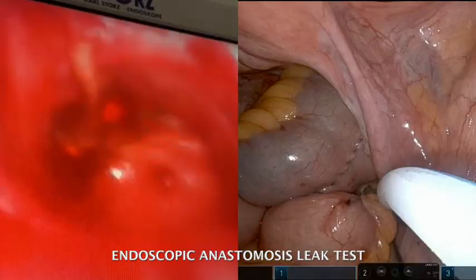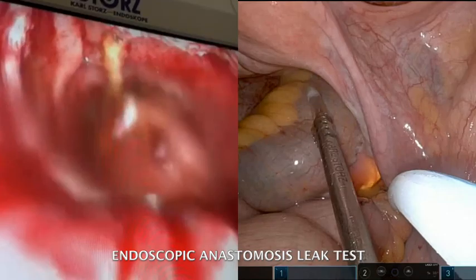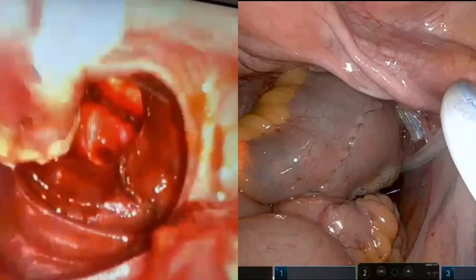A flexible endoscopy is performed to check the anastomosis and the J-pouch to assess any bleeding or intraoperative leakage. The procedure is completed by performing a loop ileostomy to protect the anastomosis.